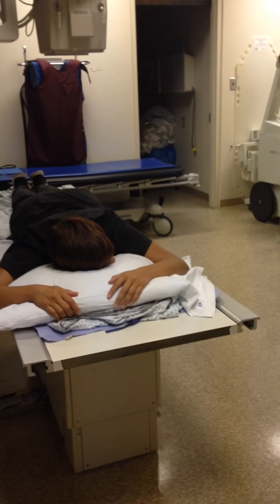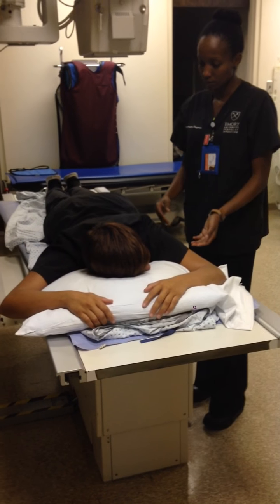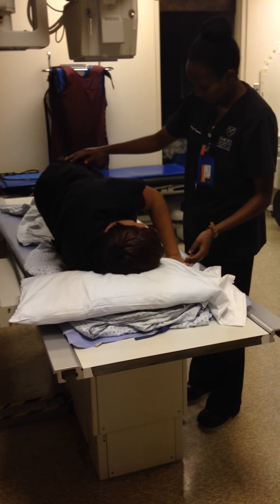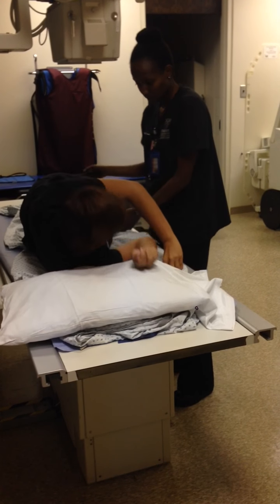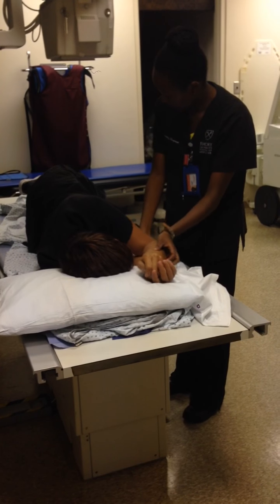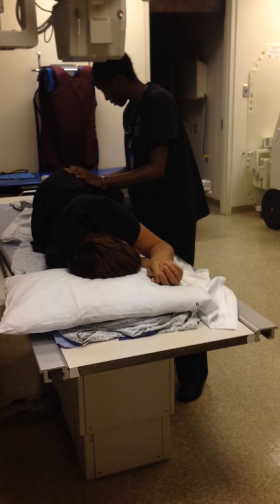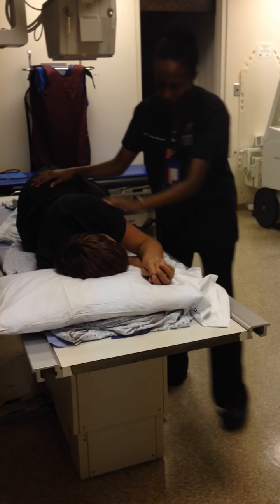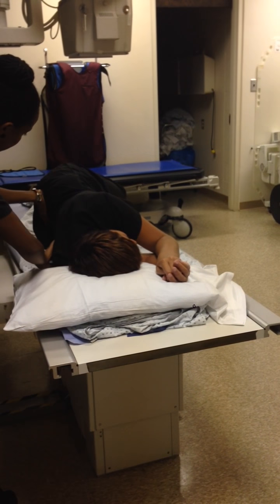The next projection will be the right lateral projection of the stomach. The purpose of this projection is to visualize the right retrogastric space of the stomach. Have the patient roll up onto the right side, facing the technologist. Ensure that the patient is in a true lateral position by flexing their arms at a 90-degree angle up by their head and flexing their knees.